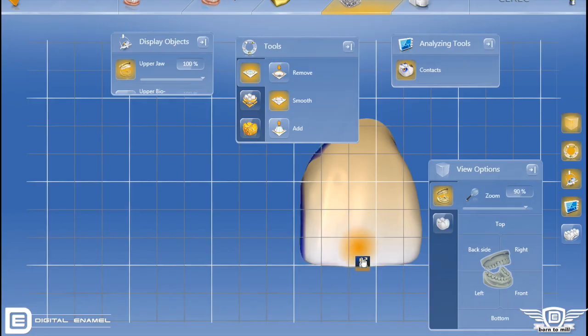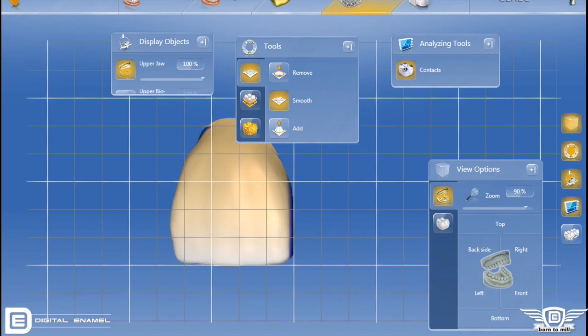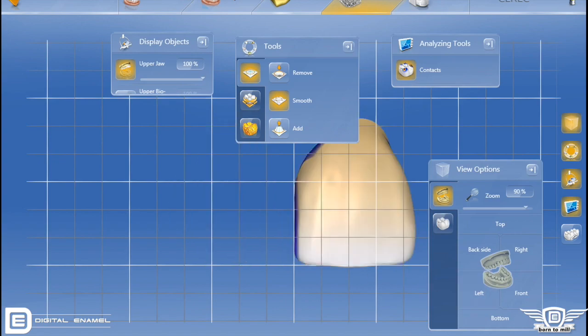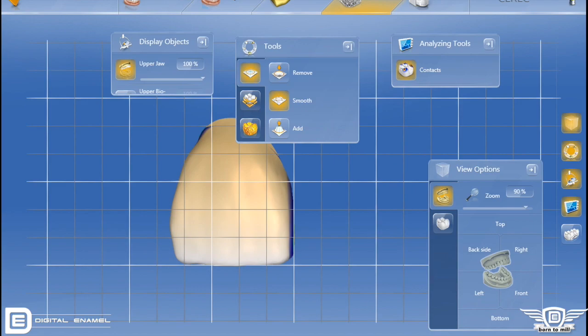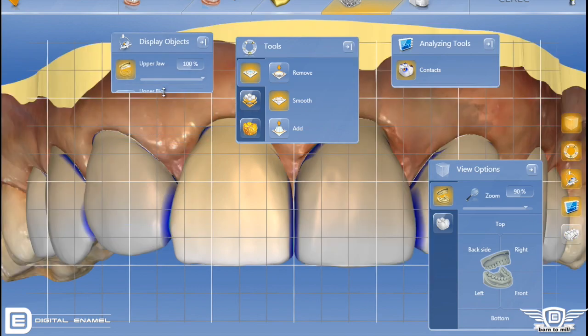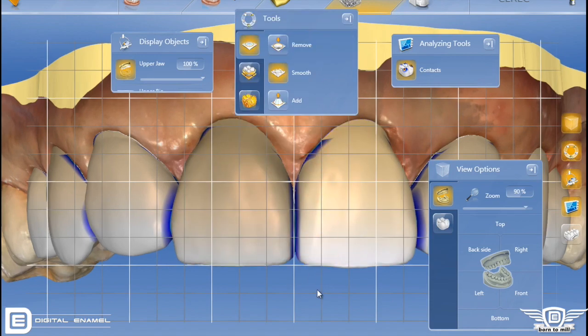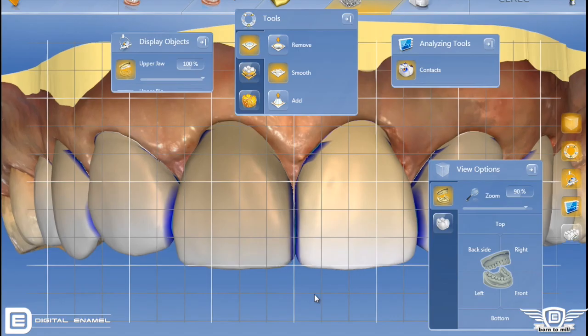Some other features you're going to see in 4.4 include faster performance. As you transition from one tool into another, you're going to see that they happen a lot faster. Sarek did a really good job of maximizing the speed for which the program actually works, and it's going to make it much faster for you as well.